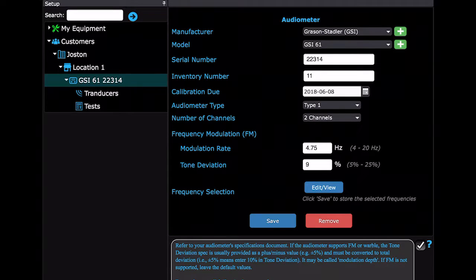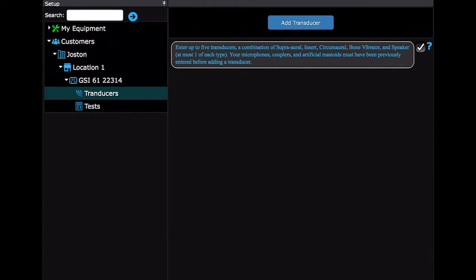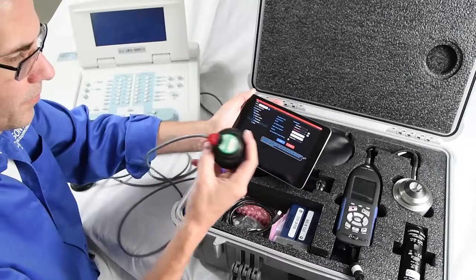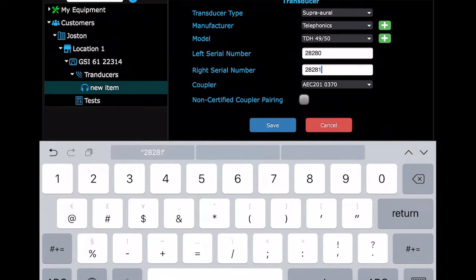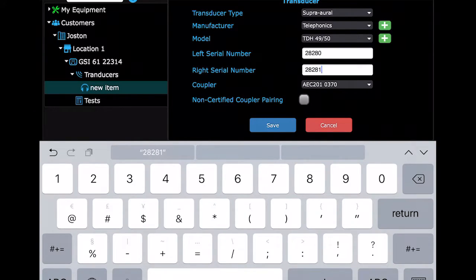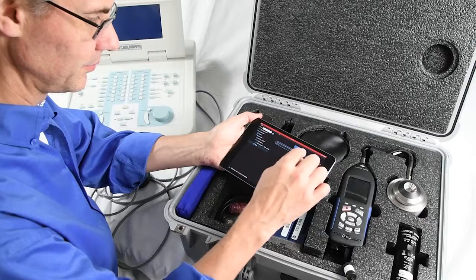To add a transducer, select Transducers in the tree view, then Add Transducer. AudCal can test many different transducers, but today we are only going to use the supra-aural headset. When it is added and saved, navigate to Tests in the tree view.